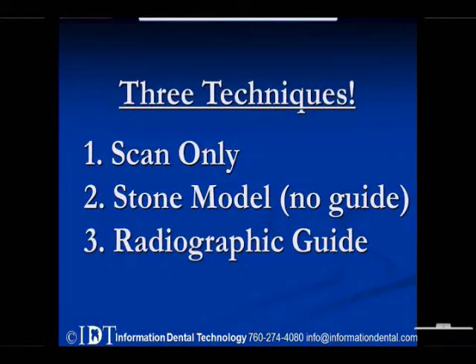Now that we can read the x-rays and interpret them properly for our expected clinical outcome, I'm going to go over 3 techniques and show you some actual cases where we did the surgery using this type of technology. So the first technique is a scan only.